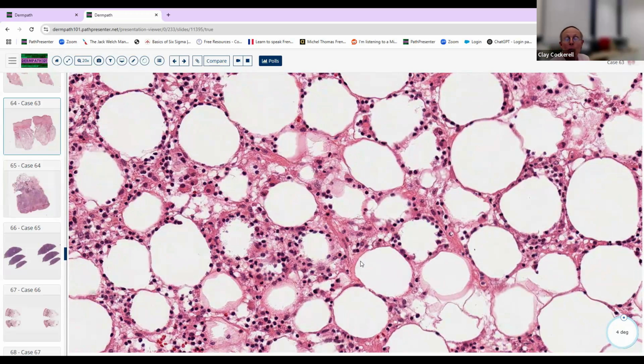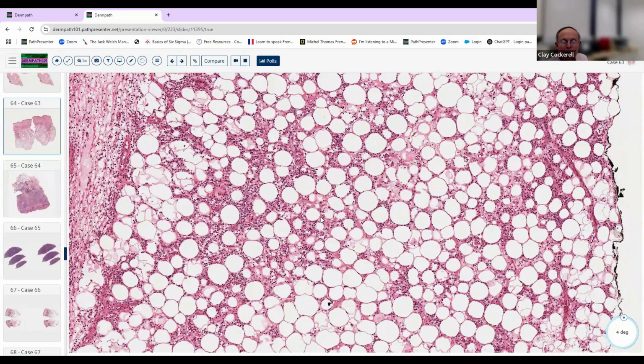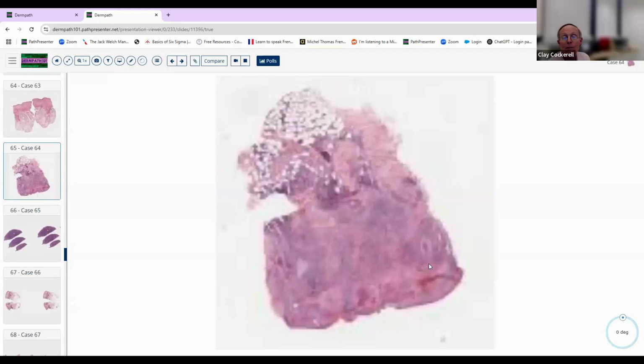There's the alpha beta subtype, which is now thought to be a subcutaneous lymphoproliferative disorder. And there's the gamma delta subtype, which is a more aggressive form of this condition. So when you see this pattern, looks like a lobular panniculitis, and it's consisting almost wholly of lymphocytes, no granulomatous inflammation, nothing else, and they're just kind of zooming in, homing into the lipocytes, I want you to think about the subcutaneous panniculitis-like T-cell lymphoma. Good example of that too.